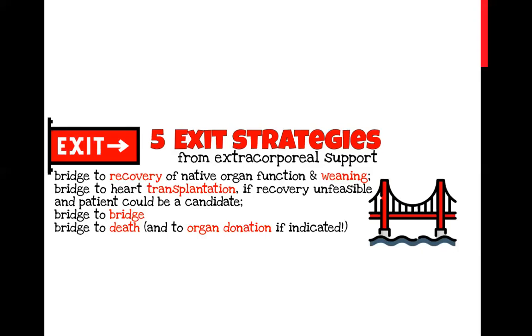There are certain cases where they do it, to minimize the side effects of the open circuit in heart surgery, for patients who are prone to complications, like chronic kidney disease patients, or patients with infection that you don't want disseminated and prone to further inflammatory reactions due to the open circuit. There are many reasons to use a closed circuit, but that's another school that not everyone follows, probably less than 3-4% of people. There is no study for or against it. However, in theory, you reduce the cytokines and inflammatory reactions, so you're less prone to hypotension and to cytotoxins attacking end organs such as the kidneys in chronic kidney disease.